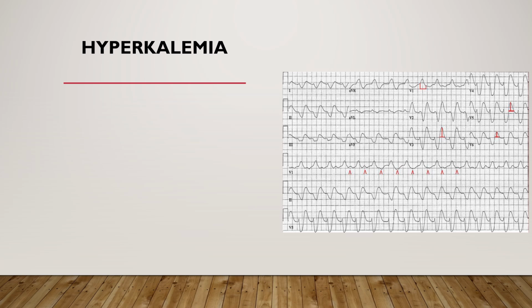First of all, let's take a look at this 12-lead ECG, which is present on the right part of the screen. The question is, do you see any P waves? I personally cannot see any P waves, so this is not a sinus rhythm. What about the rate? What seems to be the case, at least 3 big boxes are present between each QRS, so the heart rate is roughly around 100. What about the axis?